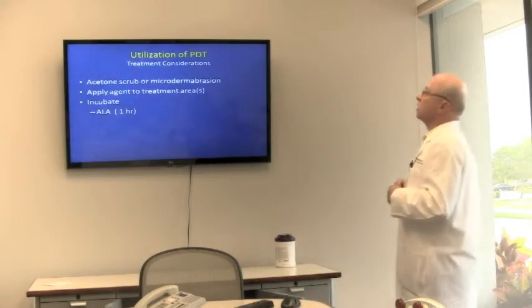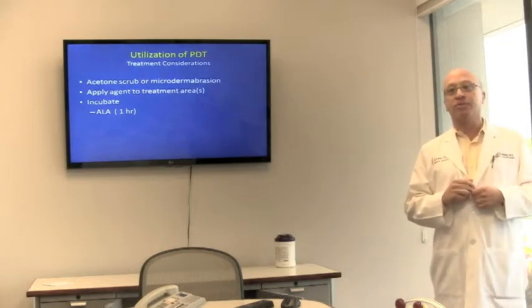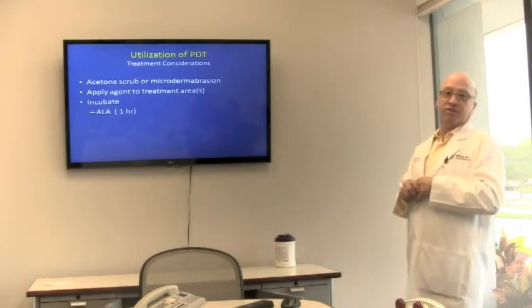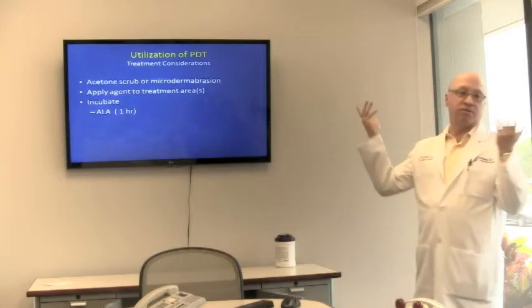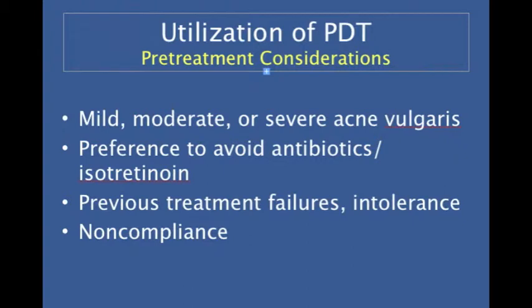And so how we do it is, we typically do a little microdermabrasion at the time. So that gets the estheticians involved, frankly. It doesn't take very long, feels good, and kind of does what the acetone does without some of that irritation. And then we use an hour, that's what we do, an hour incubation period. And excuse me, how many minutes do you do? I do 20 minutes. Okay, thank you.